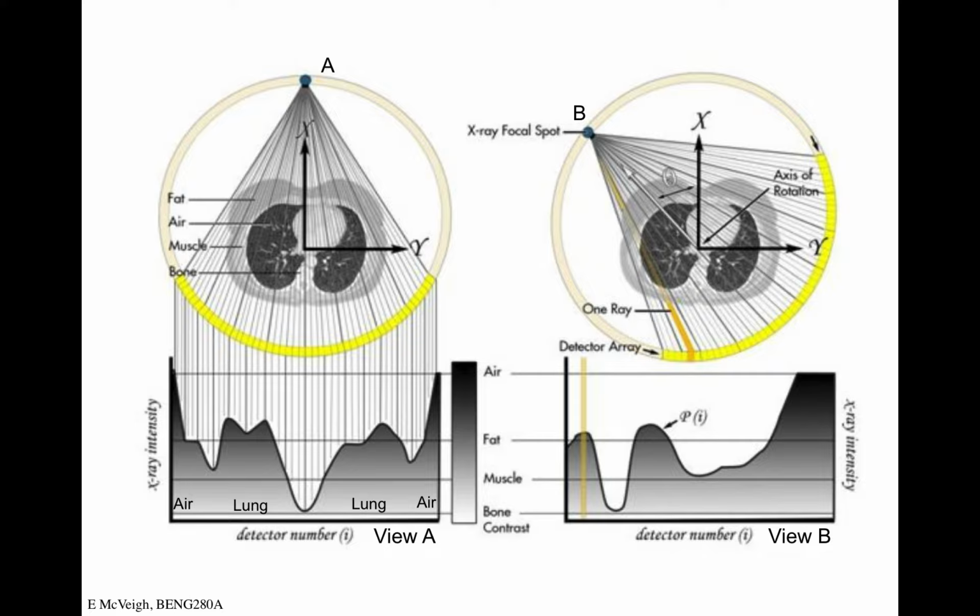These measurements actually are kind of important, because what we're going to see is you really want to know what your baseline intensity from the tube is that is being shot at the patient. You want to make that measurement, and you can make it ahead of time with nothing in the scanner, right? Which they actually often do. They calibrate the scanner and see what the intensity would be if there's nothing there, because we're really interested in the ratio of this intensity to this intensity, right?